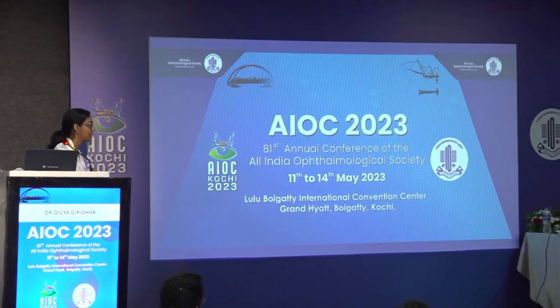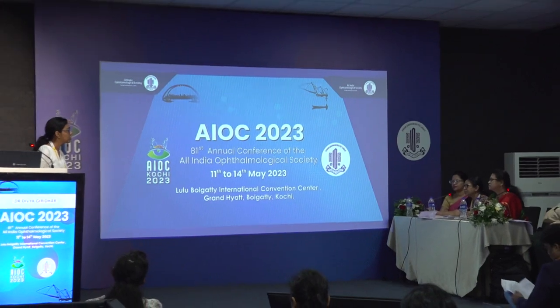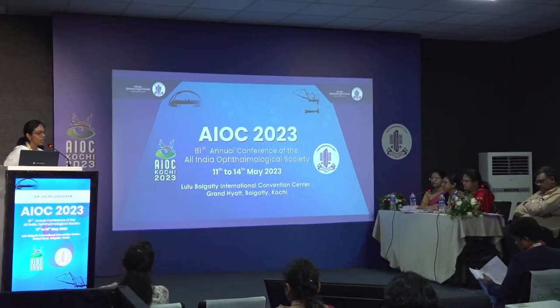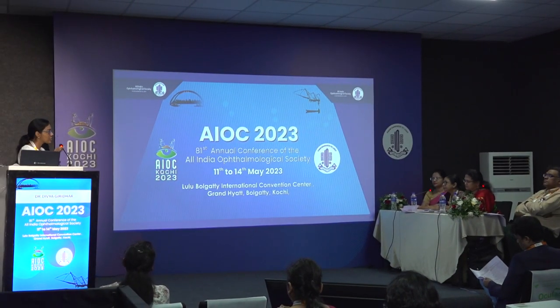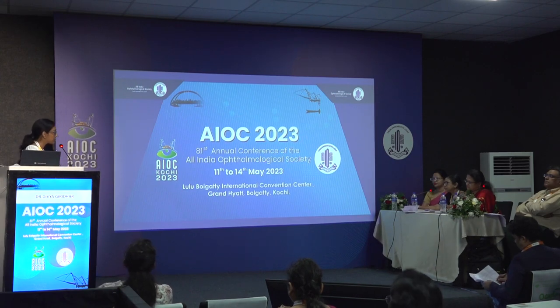Presentation, Dr. Divya. What was the interval between the first surgery and the repeat surgeries? Ma'am, that depends on the indication for the surgery. If it was a patient who had a KPRO melt or a leak and required an immediate surgery, then we would remove the KPRO at the primary sitting and rehabilitate the patient immediately.